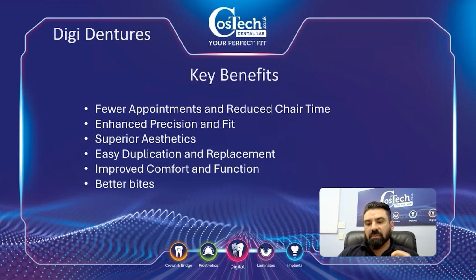Also, a lot of patients don't want to be giving up a lot of time to keep visiting. As much as they love you guys, I'm sure they want as few appointments as possible. When word gets out that they can get a denture quicker, word spreads. We do get an enhanced precision fit, being that this can only be done through a CAD, through an intraoral scanner. We get to pick up a lot more definition. We get to recreate exactly in the lab what it is.